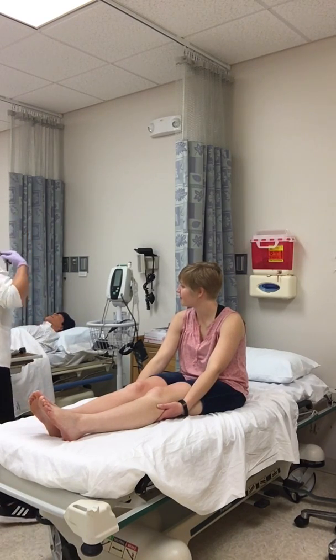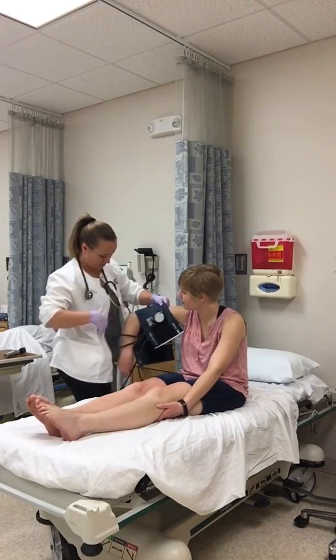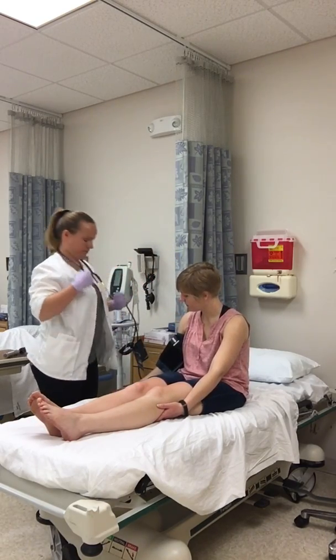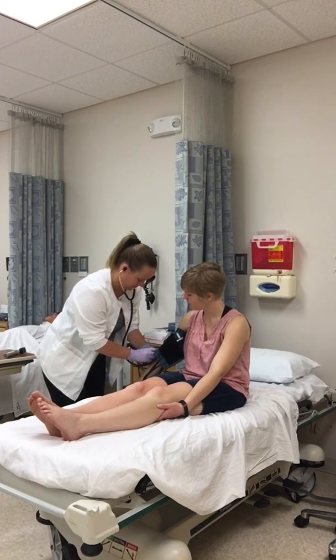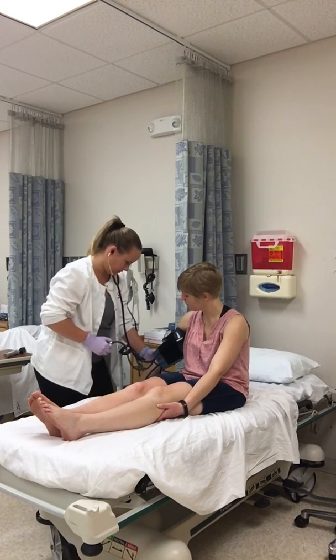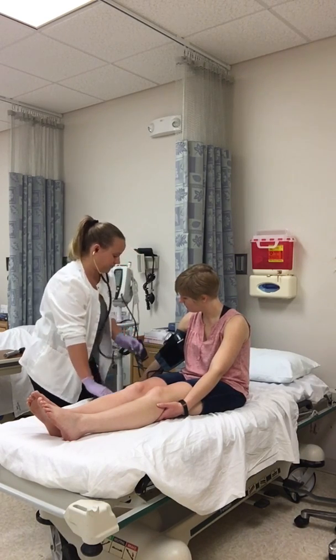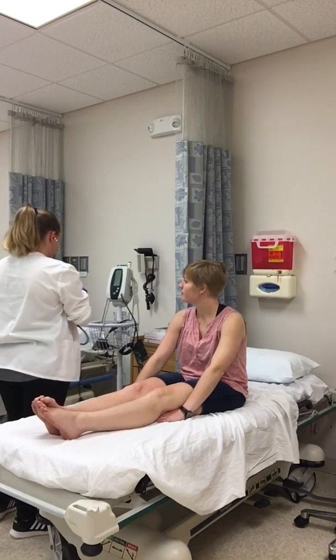All right, I'm going to get your blood pressure. Your blood pressure is 98 over 60, which sounds pretty good.